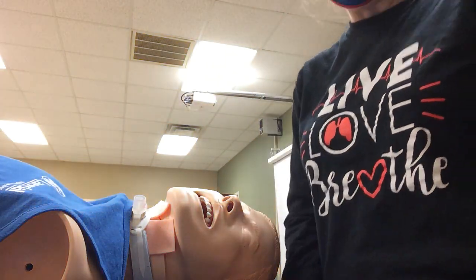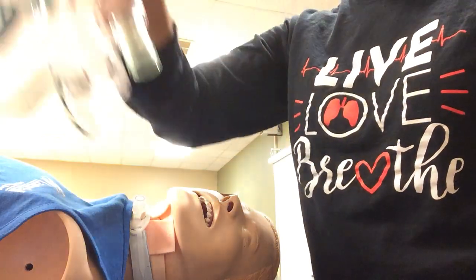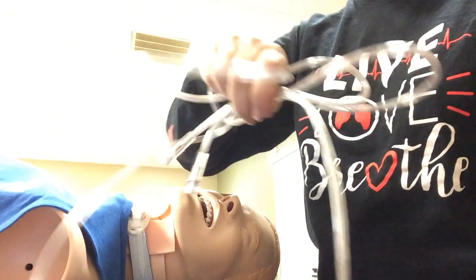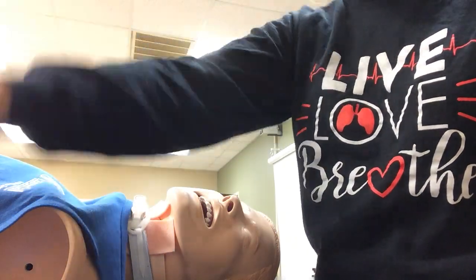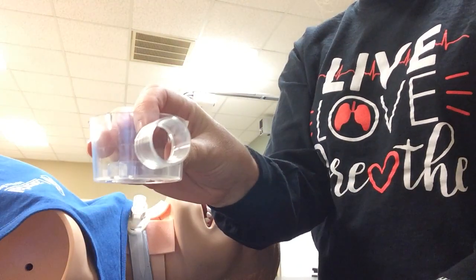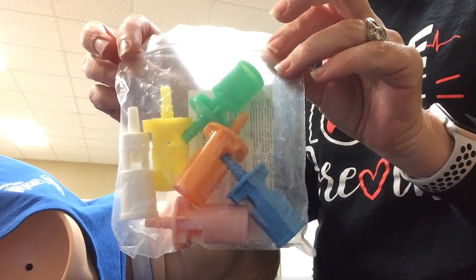For your high flow air entrainment mask, or venturi mask, you need a mask, oxygen tubing, a six-inch piece of tube to connect to the mask, your collar, and your little bag of goodies.